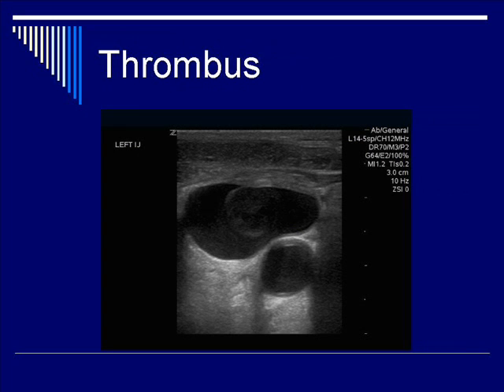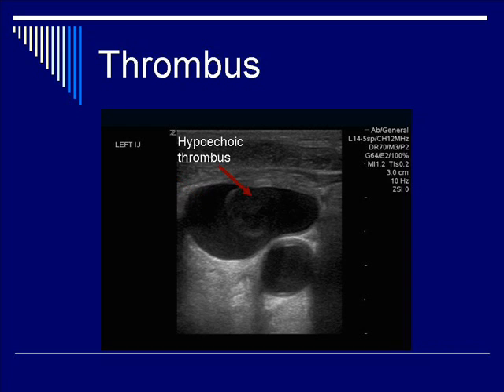The next image shows a patient's carotid region. On top of the vessel is the internal jugular vein sitting above the carotid artery. Within the vein you can see a hypoechoic structure surrounded by anechoic fluid — specifically, the black anechoic region is blood surrounding a hypoechoic thrombus in the middle. Arrows point to the black anechoic region of the vein, and then to the medium-amplitude hypoechoic thrombus residing within the internal jugular vein.